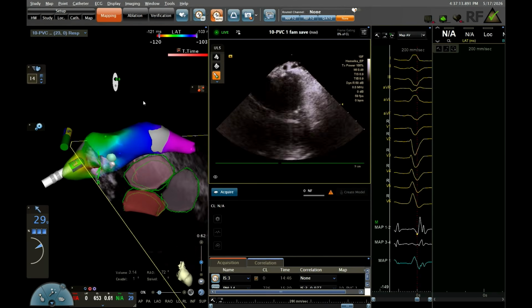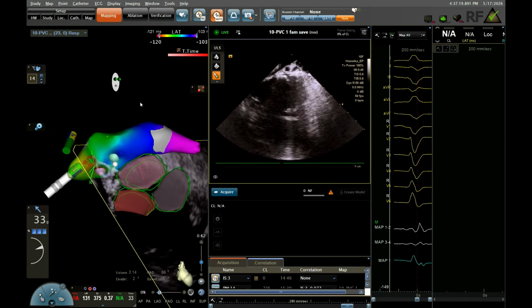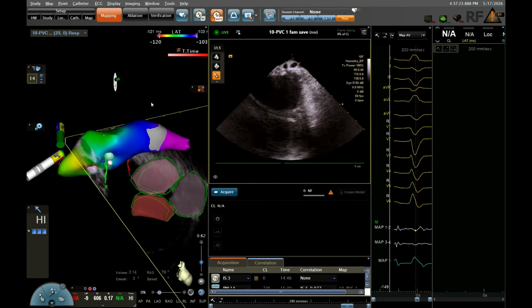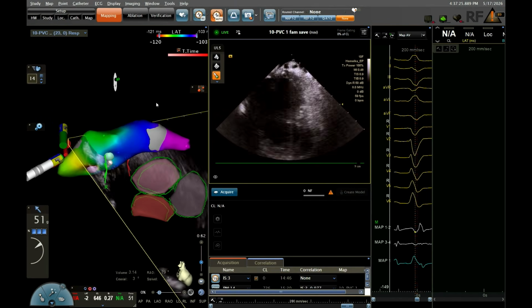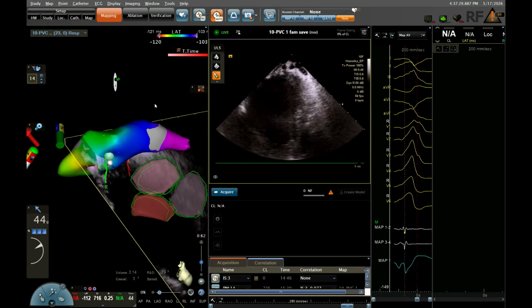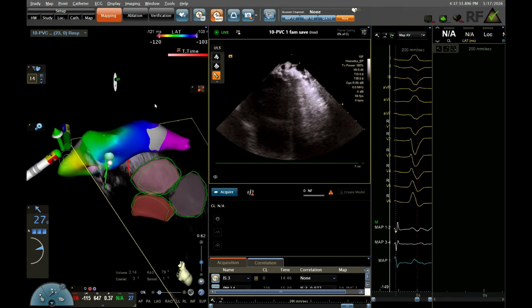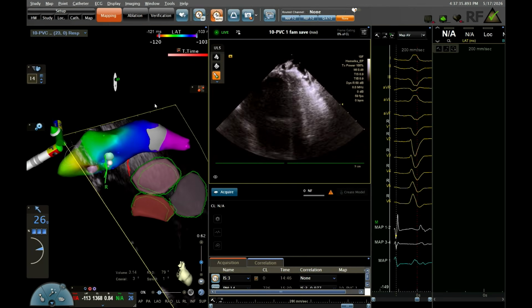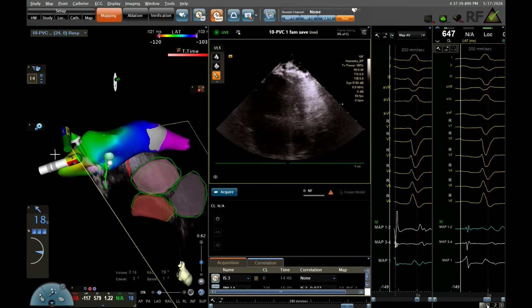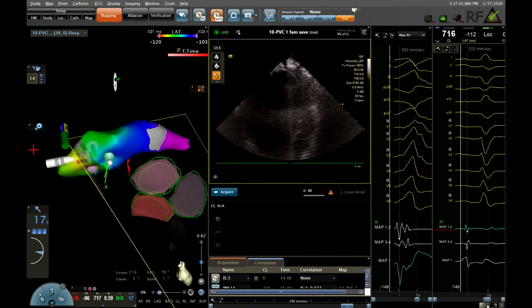Then we tried as well to go with the sphere catheter to the very distal coronary sinus and put PFA from there, but it was just temporary. And the effect looked nice for some minutes, maybe a little longer, but then everything was coming back. So now the strategy is more precise from the mapping view, let's say. But you can see that depending on how your catheter is directed in this area, you record a big A or a V.